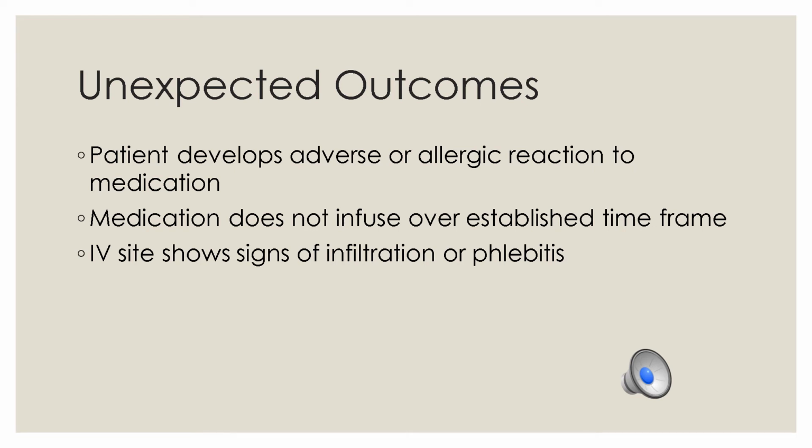And if a patient needs to receive a medication approximately over 30 minutes, we wouldn't want to use an IV bolus medication, but we could use a mini-infusion pump. That would be appropriate. We could use a Volutrol because it's controlled dosage. And we also could do an IV piggyback. To give that medicine over 30 minutes, we could program the IV pump or calculate the drip factor, which I know you all love to do.